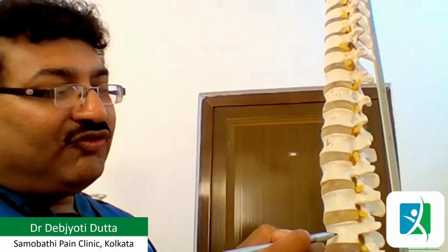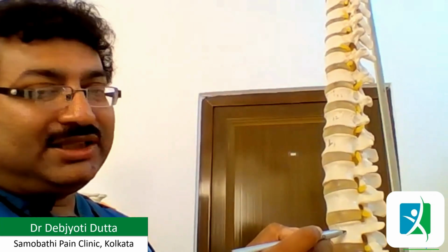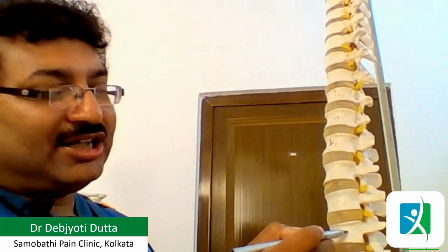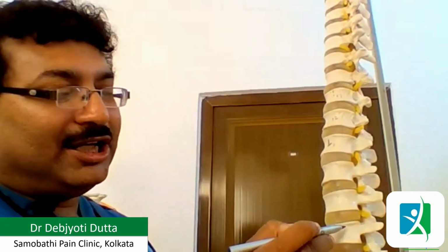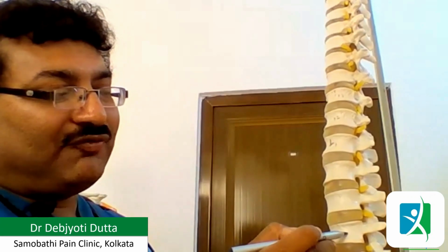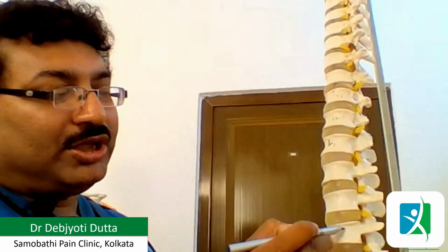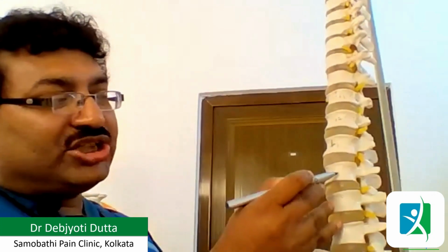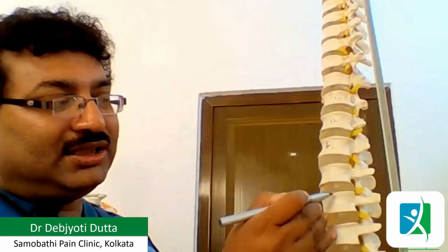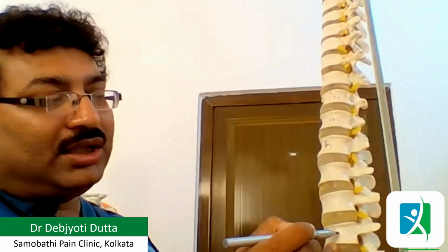The L4 sympathetic chain is most unreliable. That means the position is not always the same, but it is usually located at the middle, between the upper half and lower half of the vertebral body, again in the anterolateral corner. So we need to reach these areas, one here, one here, one here.